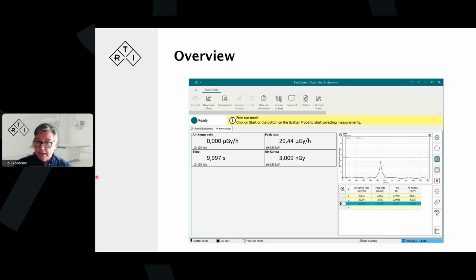Smita and Chan, is there an option to reset background radiation to 0? Sometimes they show even without any radiation. Yeah, there you go. And I think that's the peak radiation values that you're looking at. So we need to differentiate between the peak values and the actual values here.